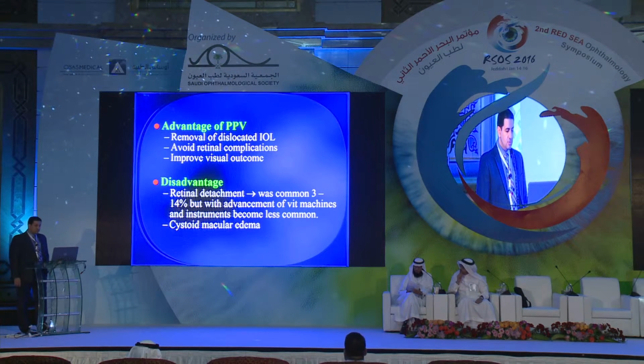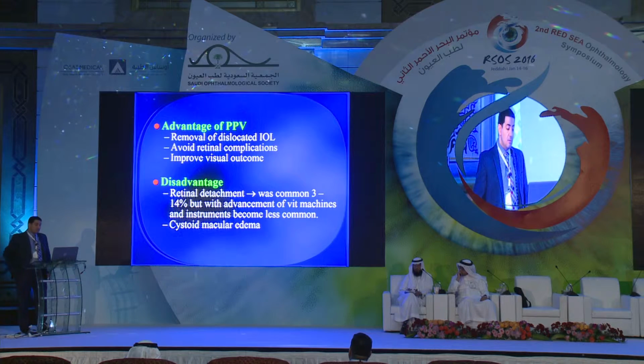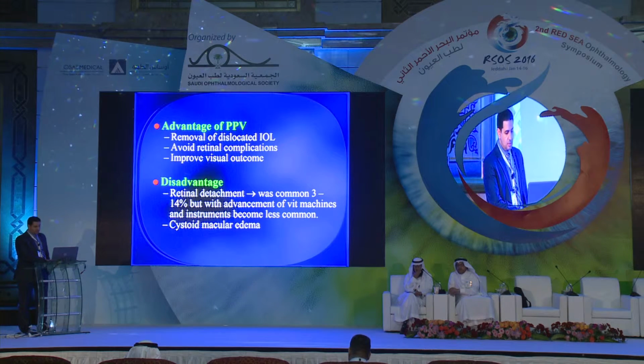What are the advantages of pars plana vitrectomy? Avoid retinal complications and improve visual outcome. Retinal detachment was commonly reported from 3% to 14%, but nowadays, with the advancement of the vitrectomy machines and the high cutting rate, I think it is very, very rare to happen.